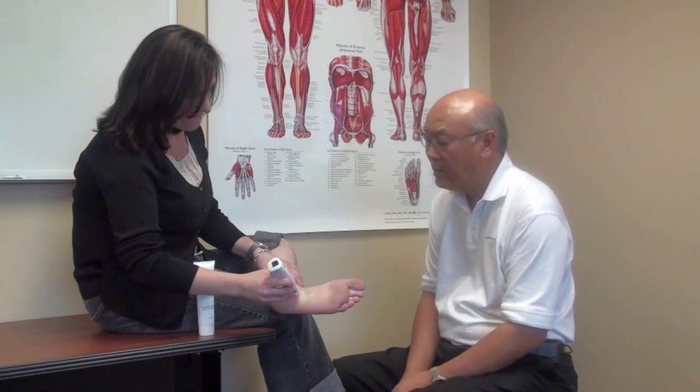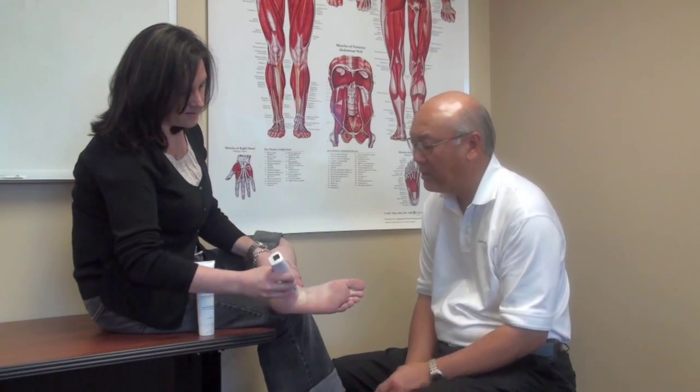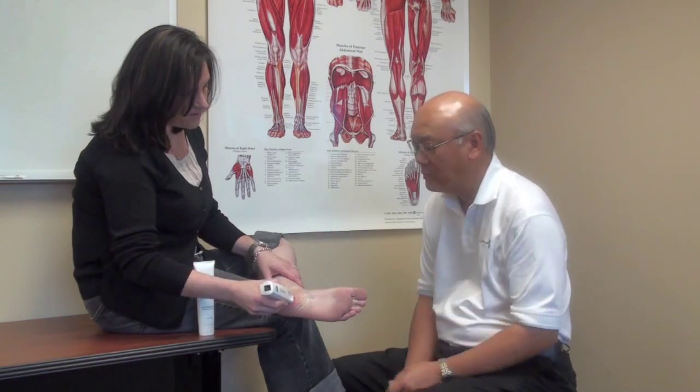Lower is always better anyway. Now, is that mainly where you've been treating? Yes. There are muscles that connect to that, both going this way and also going up.